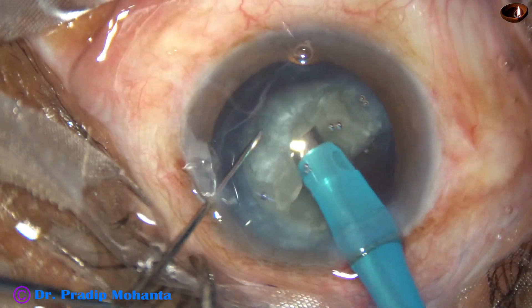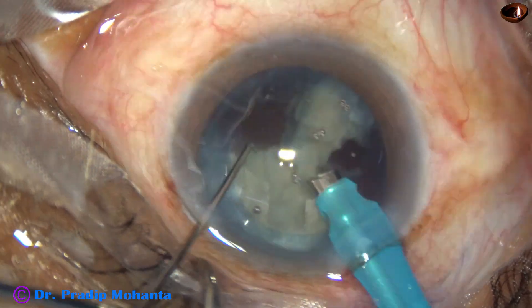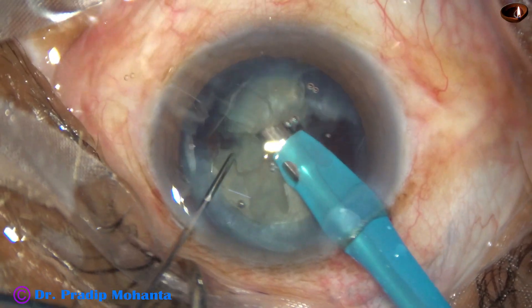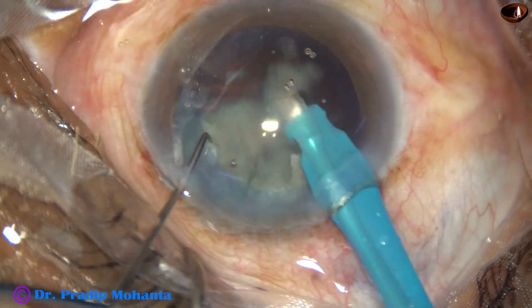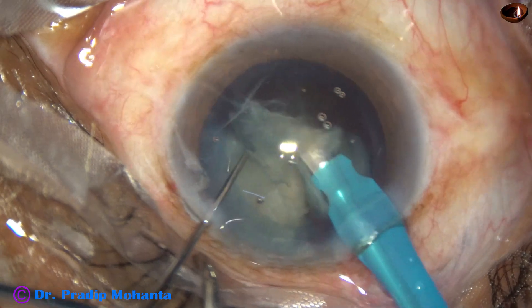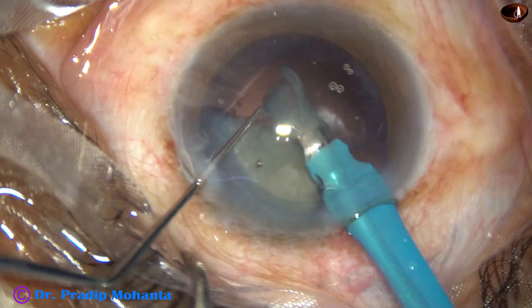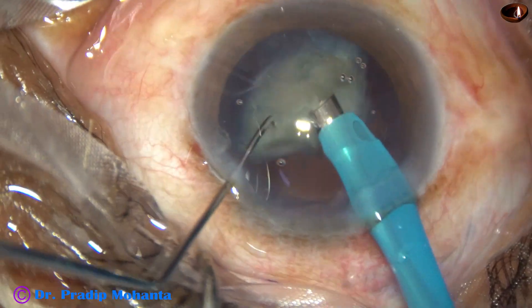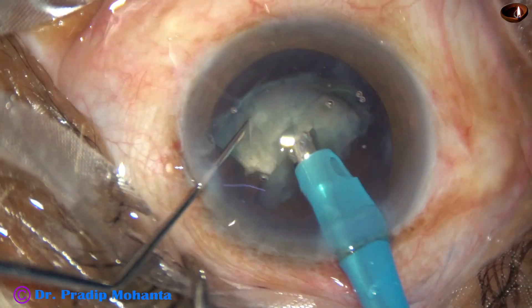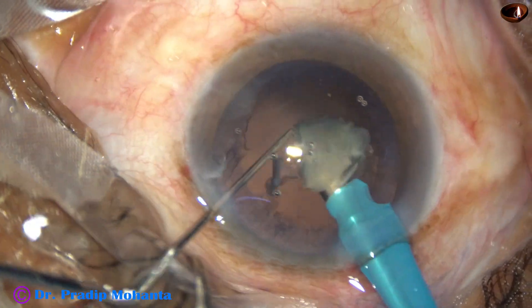At this time I am in higher vacuum — vacuum is 350, flow rate is 35, and ultrasonic energy is 60%. We always hold the thick part of the nucleus, pull it a little towards the center, chop it into smaller pieces, and start emulsifying. In this way, the nucleus is managed.